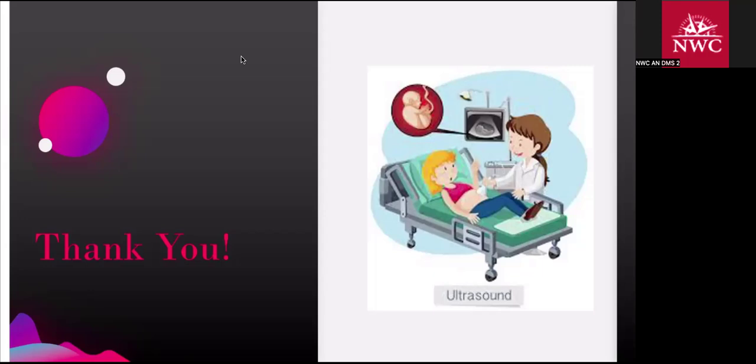That's why 17 years later, if you ever want to get the images from an ultrasound you had once, they're able to pull up the images because they're all digital and all saved. You're not walking around with pictures inside your wallet that are going to fade and deteriorate over time. PACS is what allows you to do that.